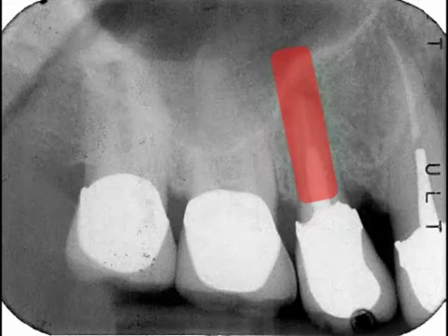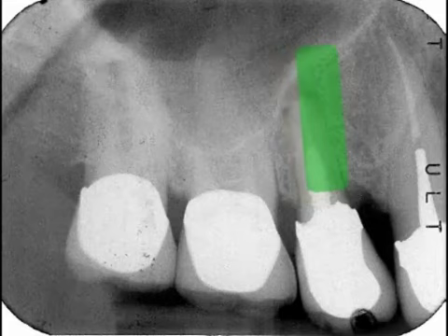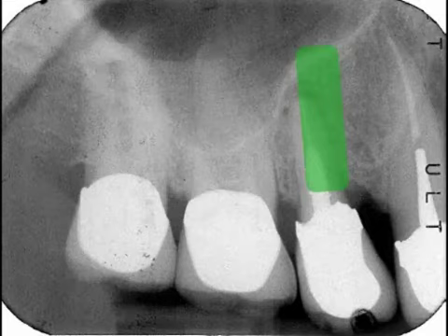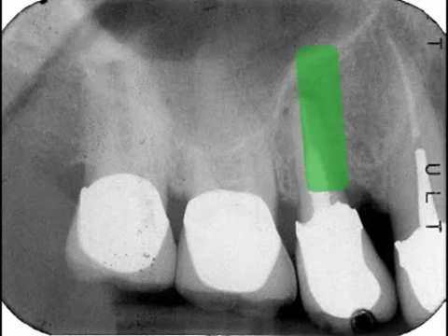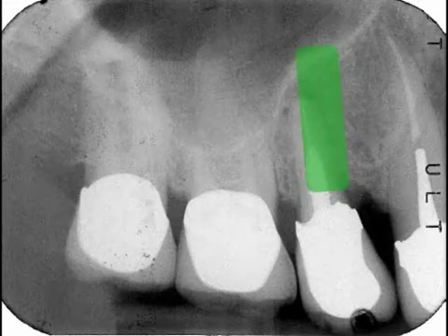So what we want to do is actually redirect the location of the implant so that it's a little bit more to the mesial, a little bit more parallel with the adjacent teeth, and we see that that will put us in a little bit better bone so that we're not going to perforate the sinus. We may engage the floor of the sinus, but that'll be fairly minimal. So we want to go ahead and place the implant in this new orientation, and if we're going to do this freehand, we're going to be doing this through the extraction socket.